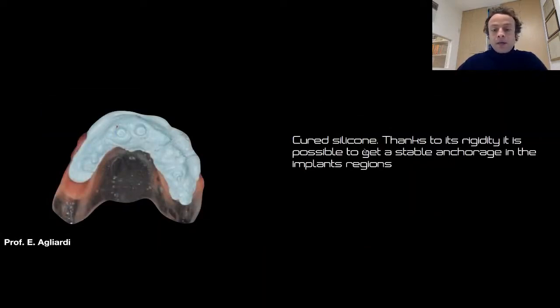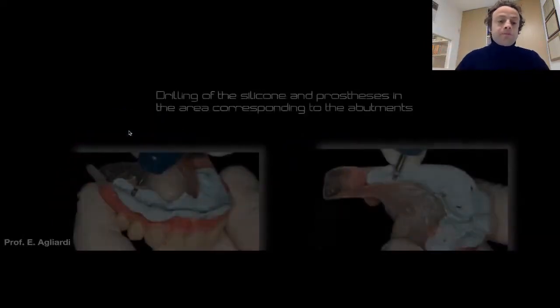So the silicone completes the setting, and thanks to its rigidity it is possible to get a stable anchorage on the implant region. Look here. You can see the implants, and you have exactly the idea of where the implants are located, and at the same time you can see a little bit of the angulation.